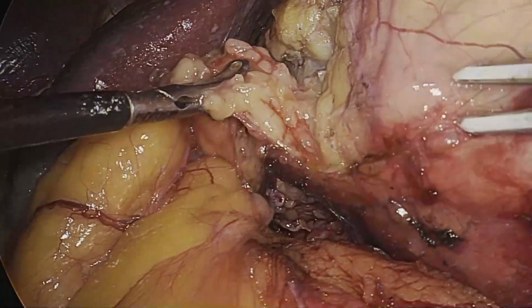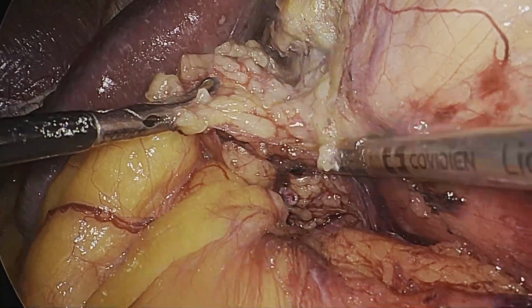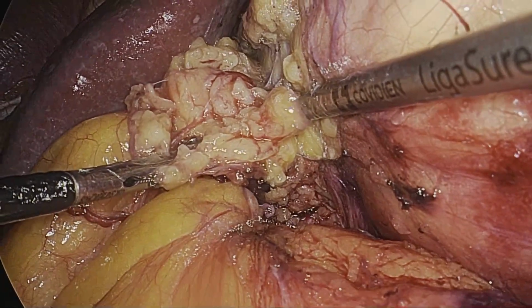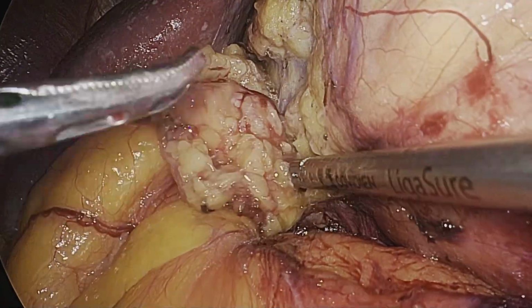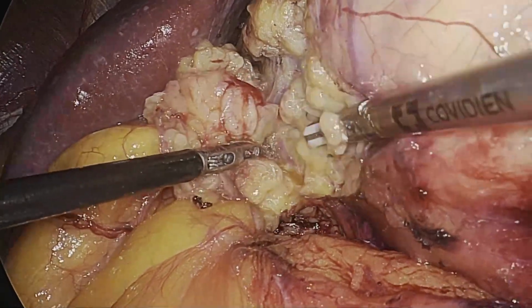If we lose this plane, the adrenal gland can definitely bleed very profusely. Another way of finding this plane is dissecting just above the renal vein and walking into the plane between the upper pole and adrenal gland.